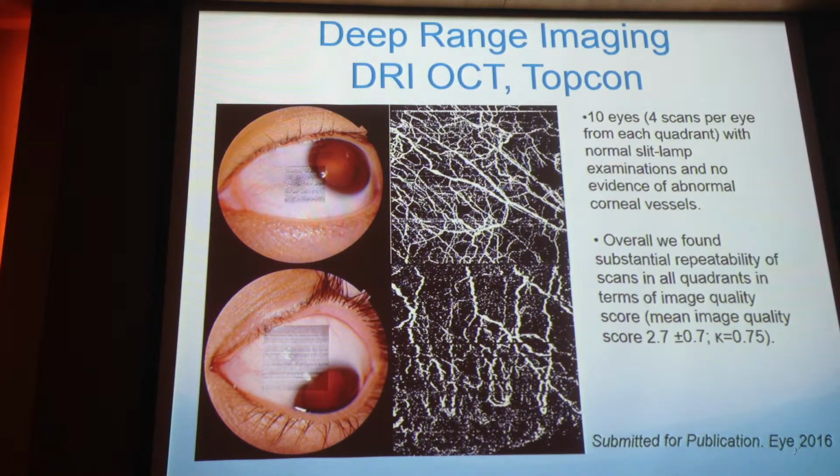And the main difference is the DRI is a swept source. It gives us more information in a much smaller area, but it also has some drawbacks, which I won't go into much detail today.